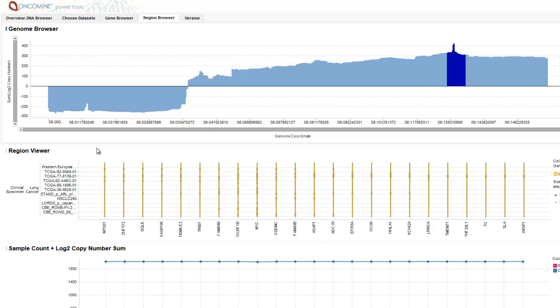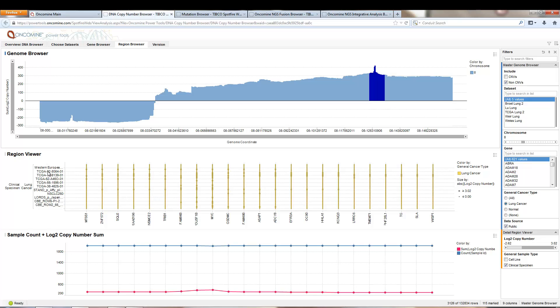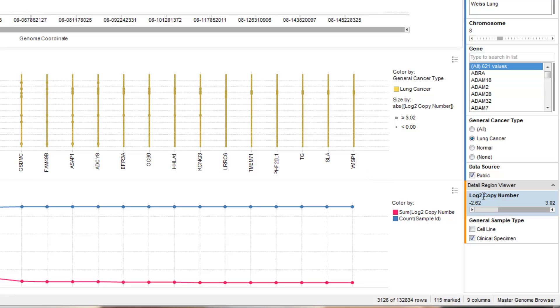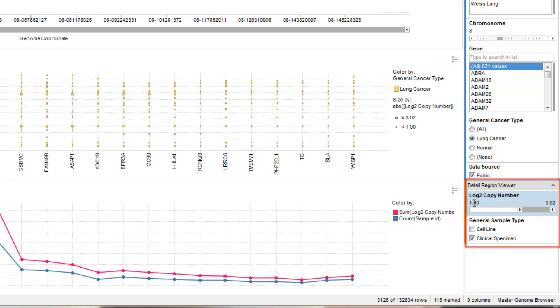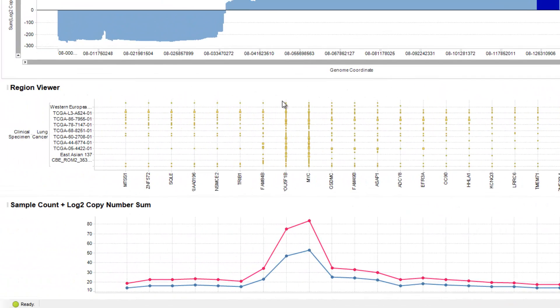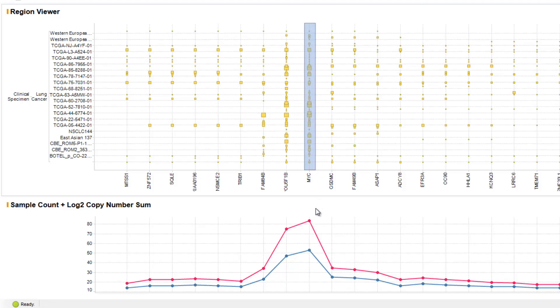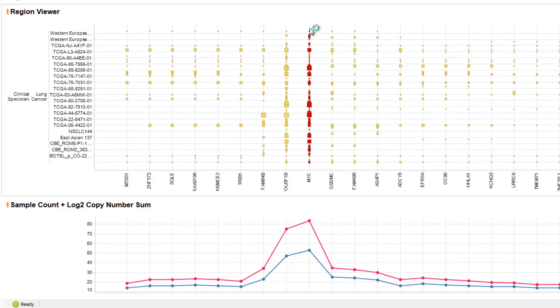That selection will then update the region viewer, which displays as rows each of the sample names, clinical lung cancer specimens, and as columns each of the genes along the genome. We can then filter to only display those samples where there are 4 or more copies. When we do that, we identify then within the region view the minimum common region across all of the patients where there are 4 copies or greater. We see, at the peak here, the gene MYC. This identifies MYC as a potential target based on this minimum common region analysis and the fact that MYC is amplified in the most number of patients above 4 copies.